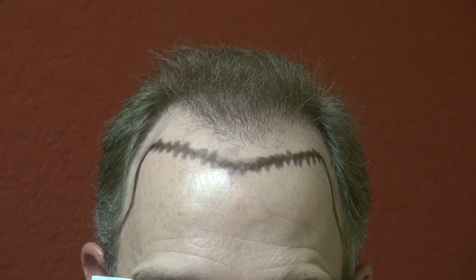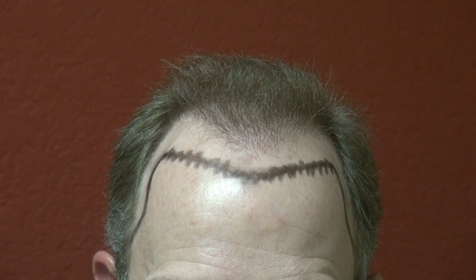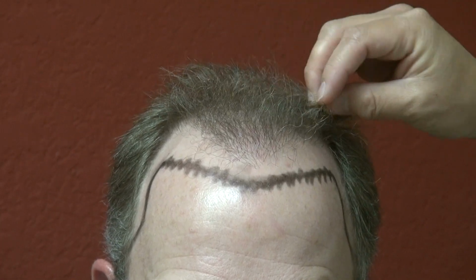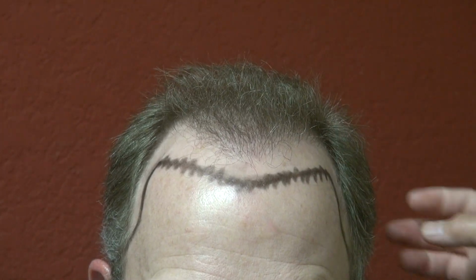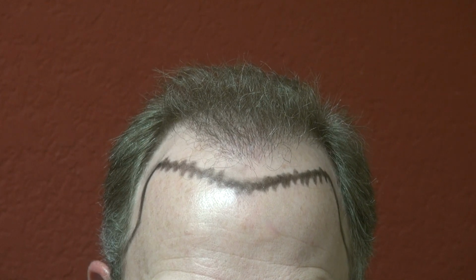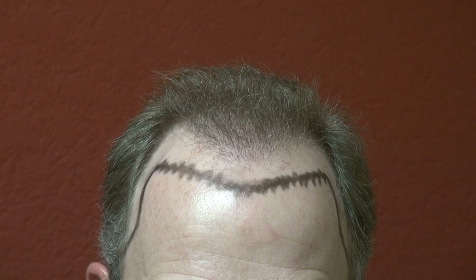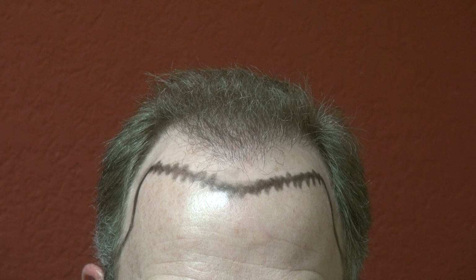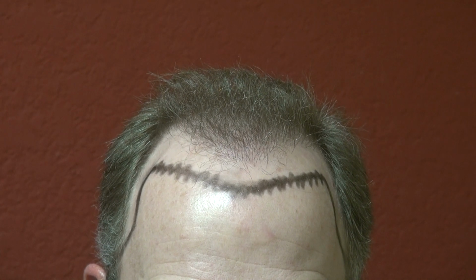Hi, this video is about the art of hair transplant restoration surgery. He had a procedure done in the past, so we leave him the tiny mini plugs, and the great thing is he has medium fine hair, so the plugs do not show much. Our goal today is to recreate the hairline, building from the front, reinforce the middle, and work our way toward the back. We will be doing at least 4,500 grafts.